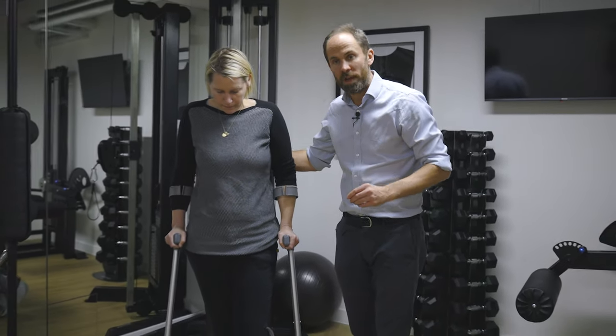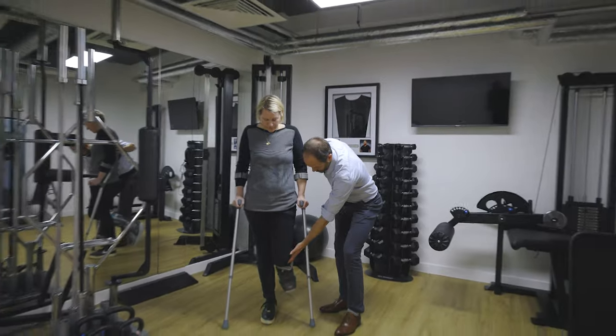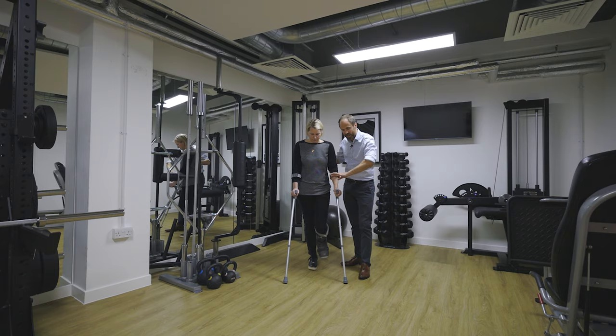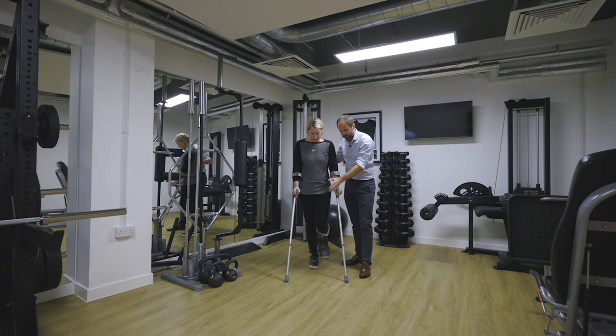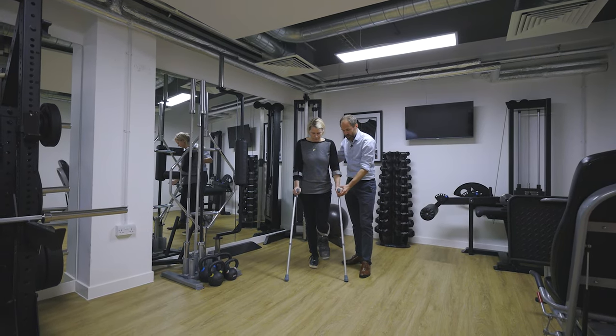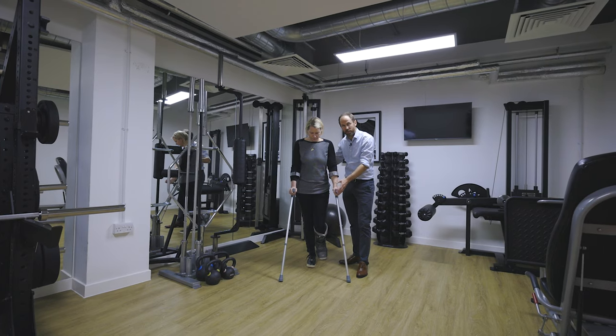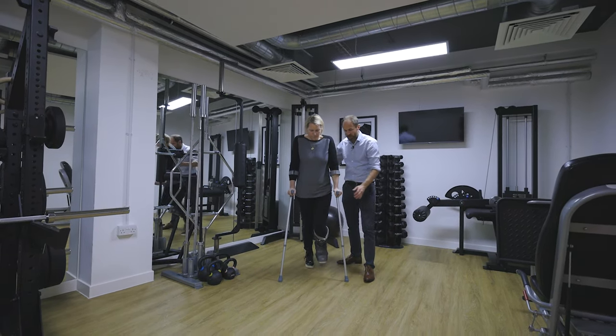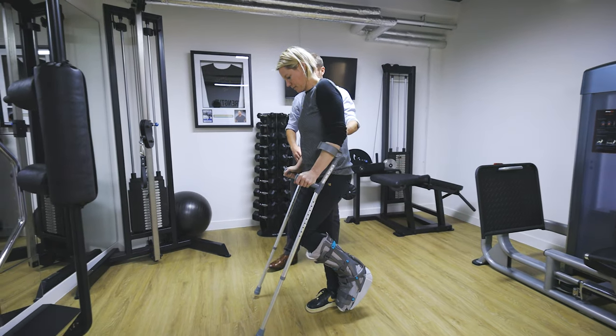Now to walk non-weight bearing, the first thing is to bend up the knee, and then the first thing to move is the elbow crutches. Bring the crutches out nicely in front of you, give yourself enough distance between the crutches to pass through, and then you're just going to hop from the right leg, and then move the crutches forward.